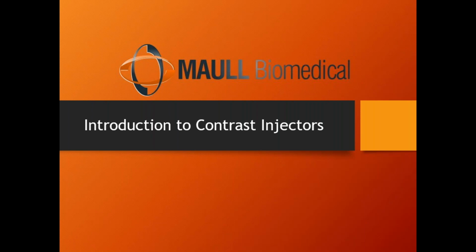I need to see the veins and the arteries. So since veins and arteries don't absorb X-rays and don't show up on X-ray images, what we have to do is inject something into the patient during the actual procedure that will block X-rays and make those blood vessels show up on the X-ray image. And that's what this is.